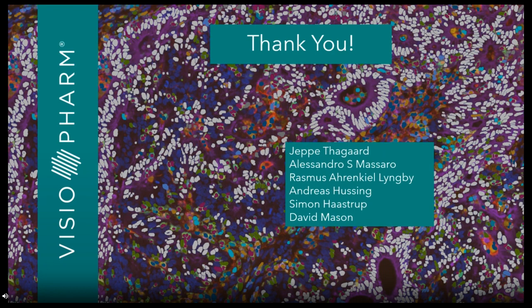So whenever we work with an antibody that is developed to work on paraffin embedded samples, then this can be developed for ISP. And we will always start from DAB, testing the sensitivity and specificity of the antibody, and then we will conjugate it with our DNA barcoding. Repeat the staining in DAB to make sure that this has not affected the performance of the antibody, and then eventually move it into fluorescence. So we can work with any antibody that has been developed for paraffin samples.